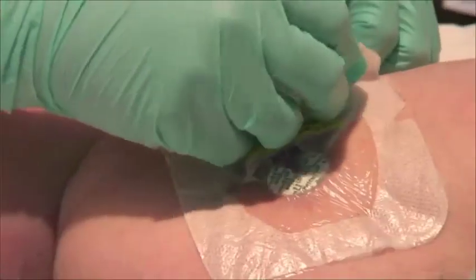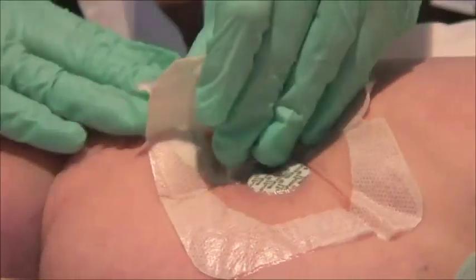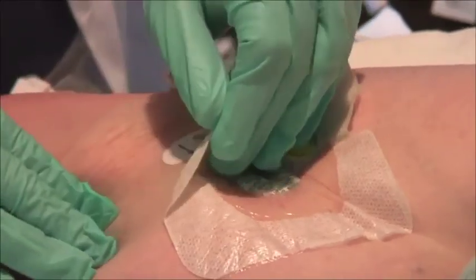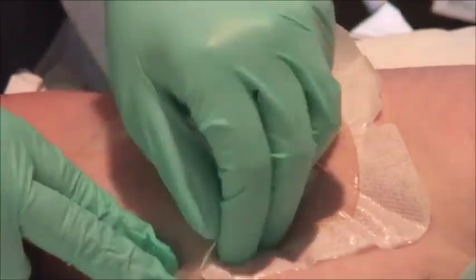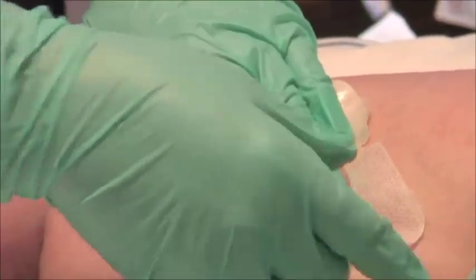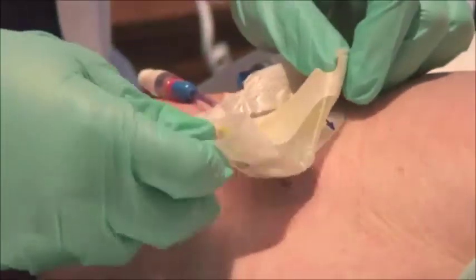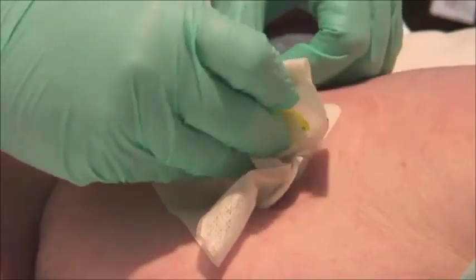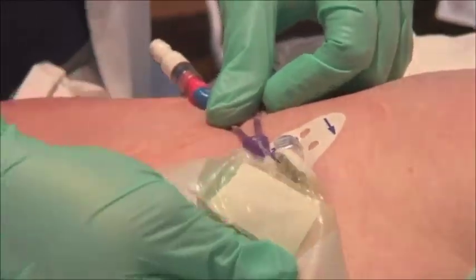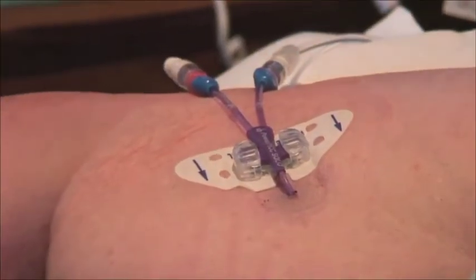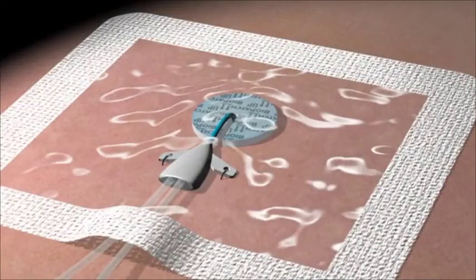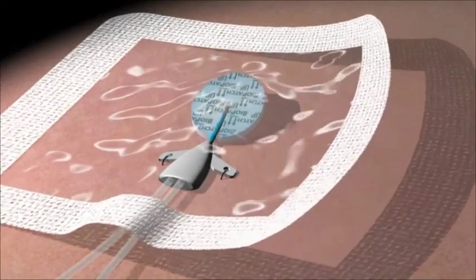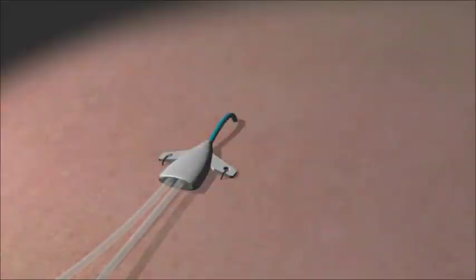When changing BioPatch, first remove the transparent dressing by picking up the corner of the dressing and stretching the dressing away from the catheter while holding the catheter in place. The dressing will partially lift. Peel back until resistance is felt. Repeatedly stretch and peel as necessary until the dressing is removed. BioPatch will remain attached to the transparent film dressing, so removal will be simultaneous.